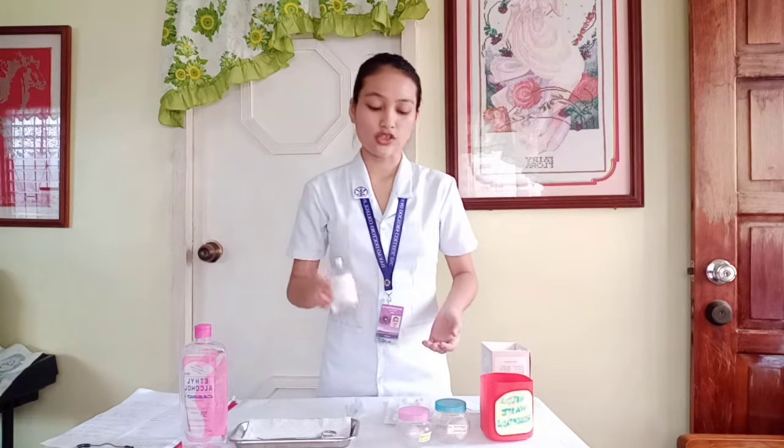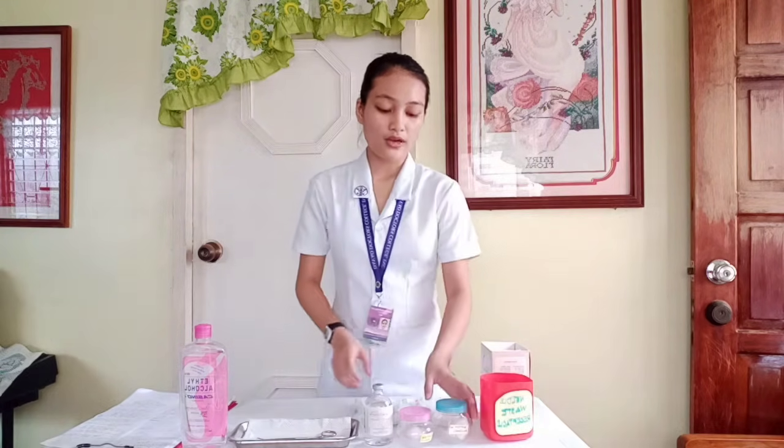I also have an aspirating needle, which is used to draw the medication from the vial, and we have sterile water, which will serve as the medication used in this demonstration. I also have cotton balls. One is soaked in 70% alcohol, and the other one is just dry cotton balls.